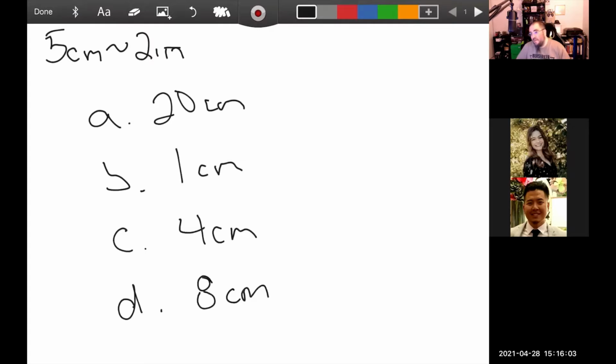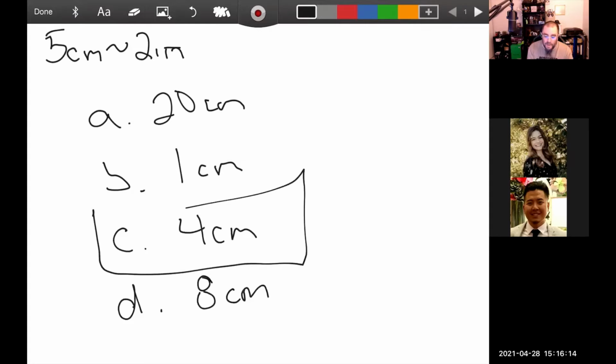So if you look at that and you go, well, Mr. McKeever, you said the max depth of penetration is 5 centimeters, right? Remember, I said 3 to 5. So that's where you go, okay, this one falls in that range, so that's my choice. All these other ones are out, right?